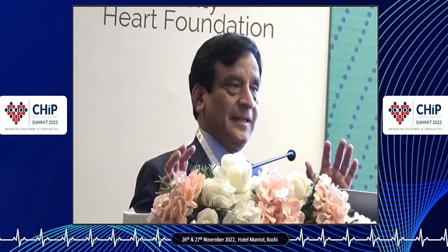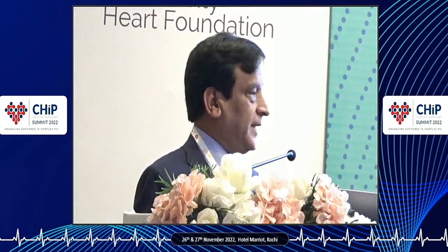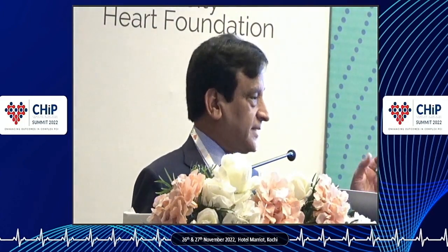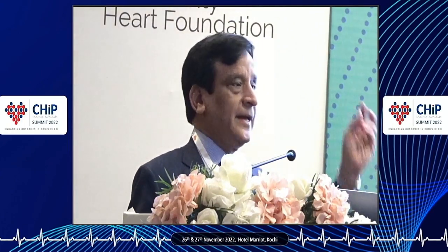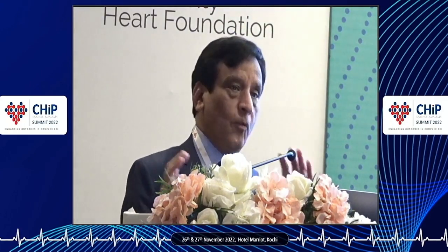So remember I said that in many of our live cases, you have done everything. You have done the pre-procedural modification, you have done, let's say, the small rotational atherectomy, your high pressure balloon looks good, you put a stent, now you do IVUS. And in one area, because there was a calcific nodule, you still have a lumen that is not optimal. So the question is what you should do further.